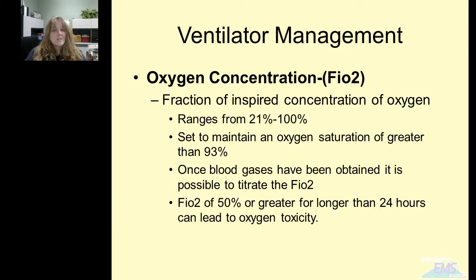Now that's not necessarily a good thing, because what they have found is that when you have saturation levels greater than 94%, then you actually move into oxygen toxicity. So when we're dealing with these patients that are on a ventilator and we're trying to set that fraction of inspired O2, we're trying to maintain an oxygen saturation of at least 94%. If we've got it at 94%, then that's fine, leave it there. We don't have to keep increasing it to get to 99%, for example.